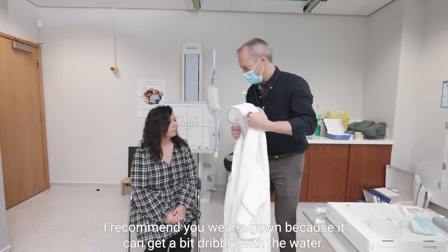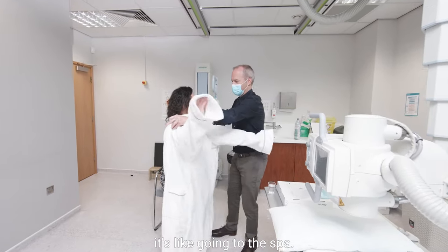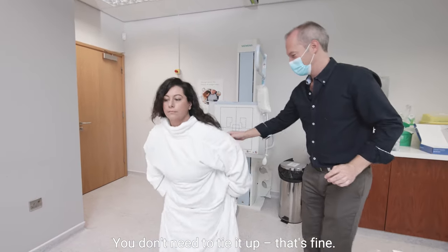I recommend you wear a gown because it can get a bit dribbly with the water. So if you just step into this back to front — that's it. It's like going to the spa. And then just take a seat. Don't need to tie it up, that's fine.